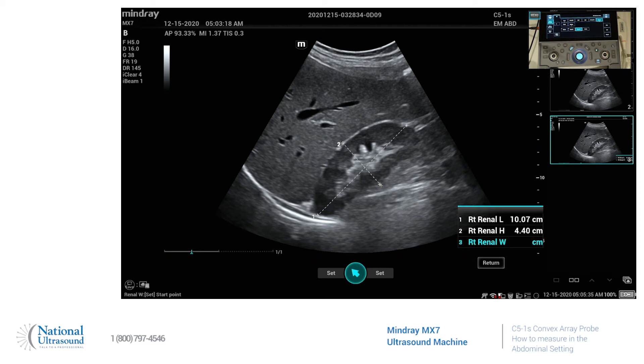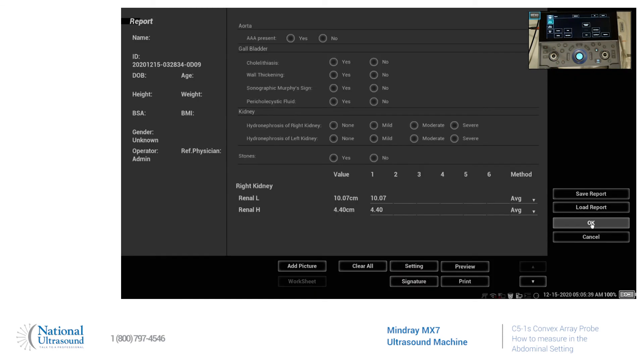Obviously, you'd want to go in trans for that. If you want to pull up your measurements, slide that, go to report, and your measurements are all going to be listed here.